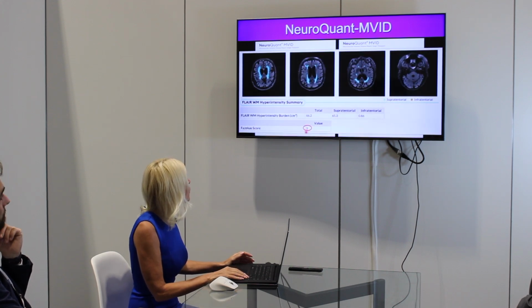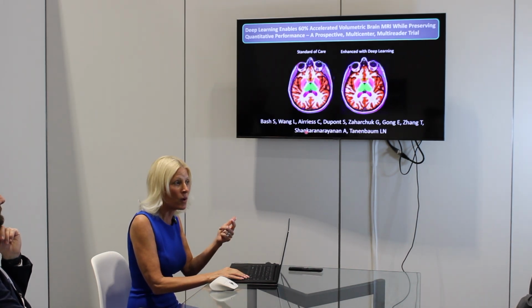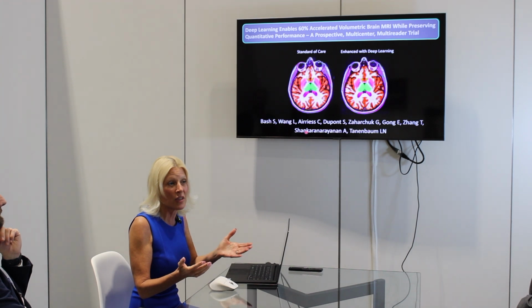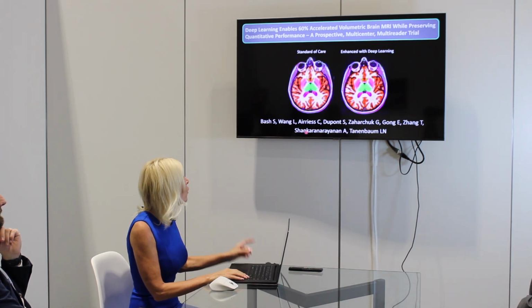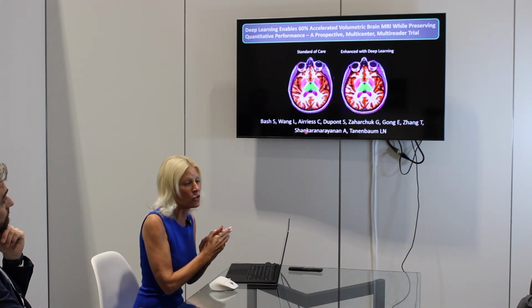And this is just a closer look up here at the FLAIR, and at this report. And eventually we'll also incorporate infarcts as well. And now that we have the capability, we can actually look for cerebral amyloid angiopathy and quantify the number of microbleeds too.